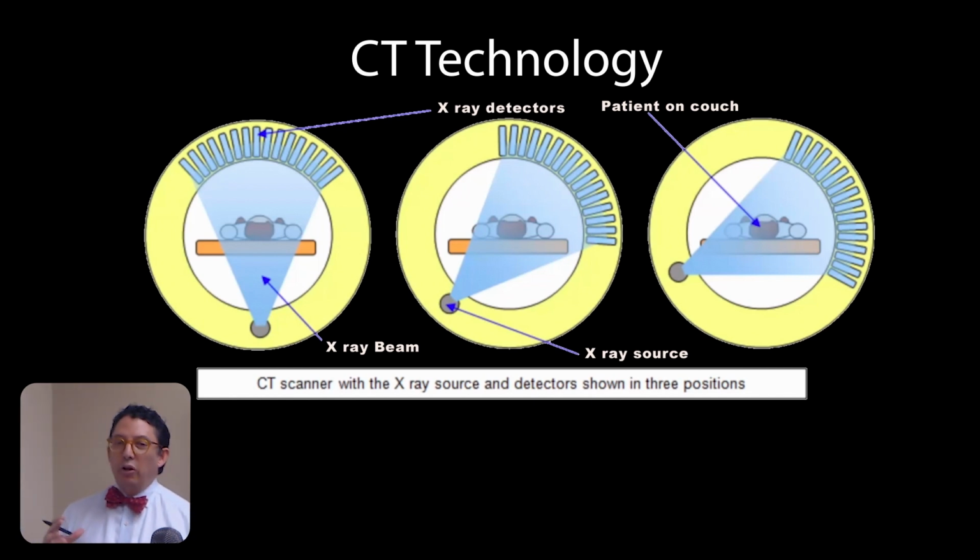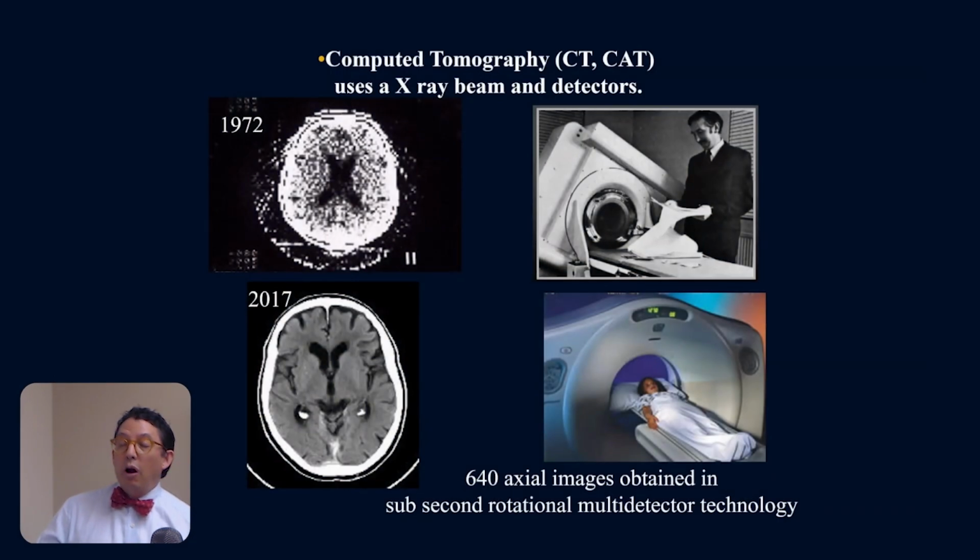So how does CT technology kind of work? Again, we had this beam, which was an X-ray. You put it into this round structure that went around the patient, and you rotated it with slightly different angles, and the detectors on the other side would also do that. And then a computer would just see the information that was coming from that to reconstruct the images with very complex mathematical algorithms. So we've gone a long way from that.